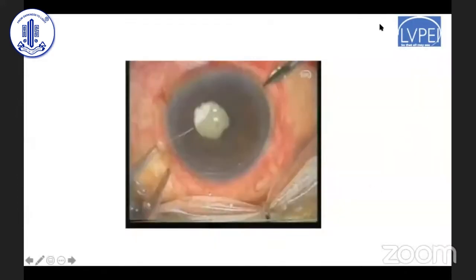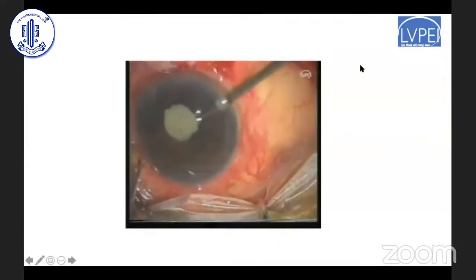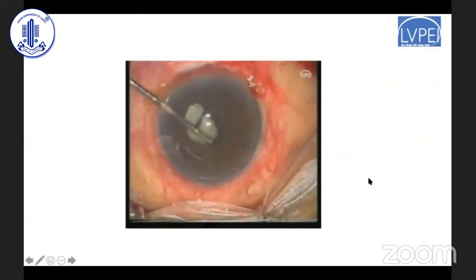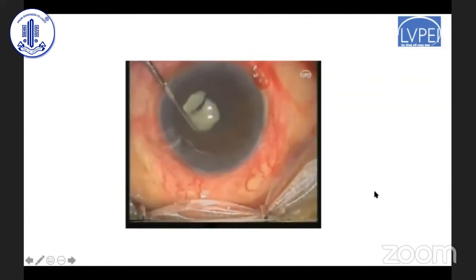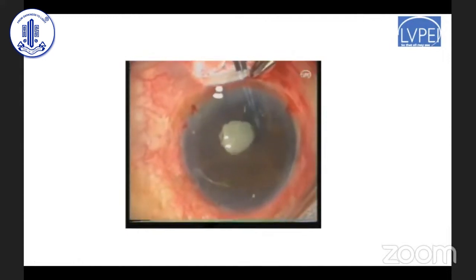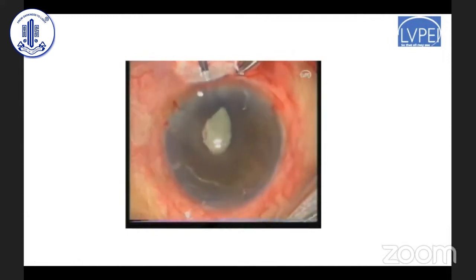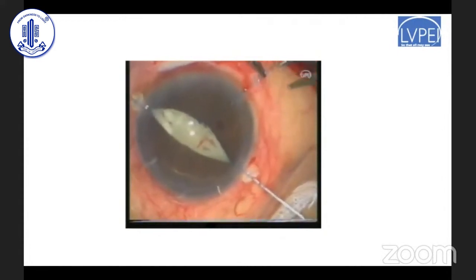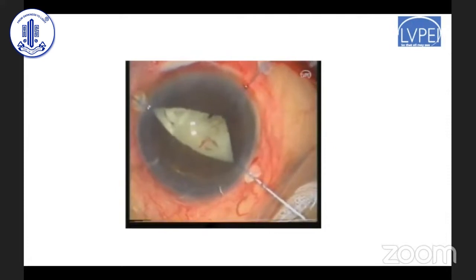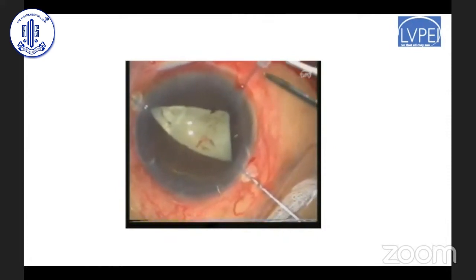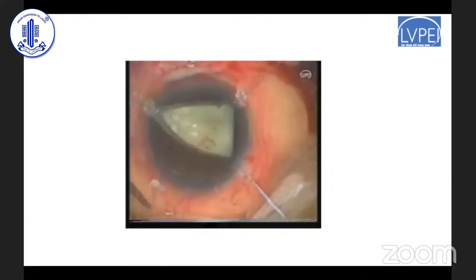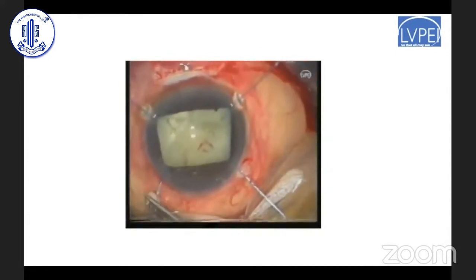This is another case where the synechiae are much harder, the cataract also has more advanced nuclear sclerosis — a total cataract — and there is a large pupillary synechia with a membrane which goes even behind the iris, as you can see when pulling it out. These membranes should be carefully removed. We use four iris hooks to nicely dilate the pupil, and once we have very good exposure of the hard cataract, the surgical procedures can be done fairly easily.